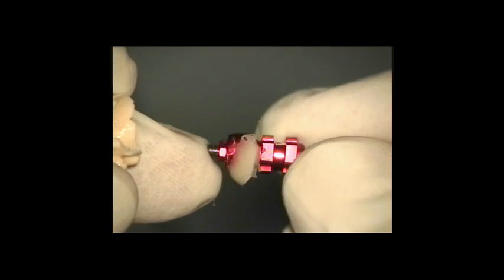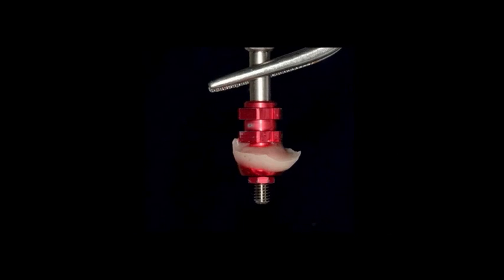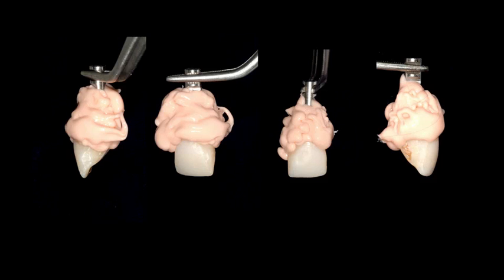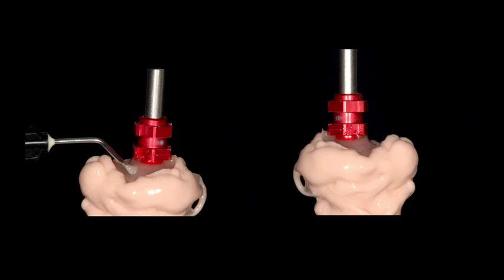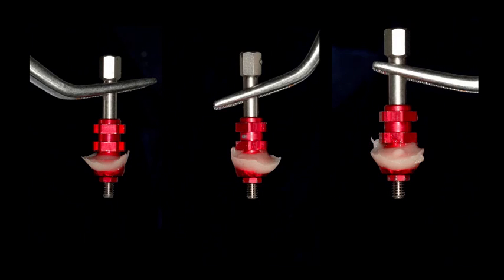So here's our transfer. It's basically shaped like the provisional crown now. And we can take this and screw it onto the implant. We take two of them, and we basically are supporting the tissue. So here are the two provisional crowns. Here we've coated them with Mach 2 disilicone. And now here's the space that represents the shape and the contour of the provisional crown. We put flowable composite resin into this space and attach it to the implant transfer. And now we have a transfer that's customized to represent the aesthetic outline form of the provisional.